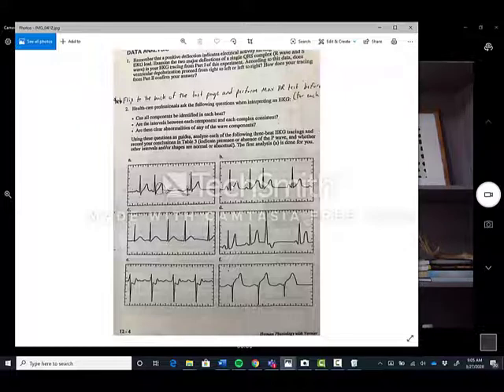So letter B, the difference between the interval, which is time, and the shape is, you want to see, did it take too long? Did it not take enough time? So let's see here, a T wave or a P wave. We'll go through this one just because it's easiest. You notice that the P wave, I would say that the shape is okay. So mark that in the box. The shape for the P wave is going to be okay.